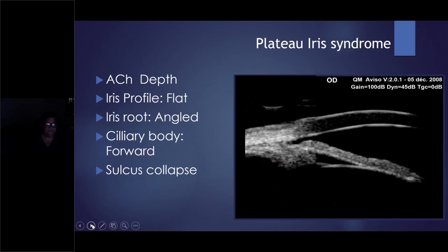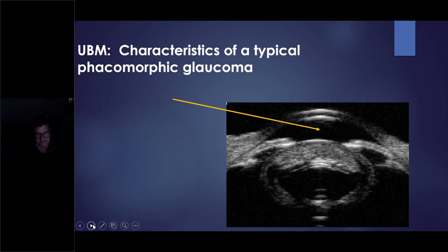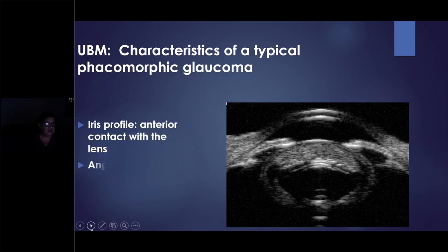Phacomorphic glaucoma. This is for me the most important area that you can use. I personally use it a lot. This is my practice. Look at the iris profile, anterior contact with the lens. You see the angle closure. You see a big lens and inner lens pockets filled with liquid, and they are waiting for you to make the operation and get the break of the capsule.